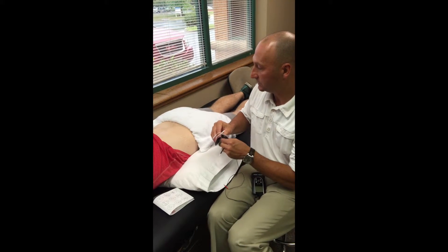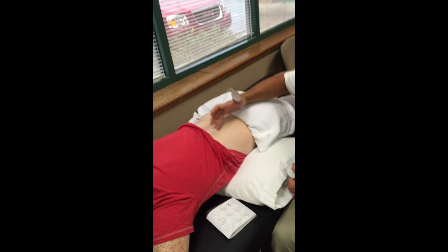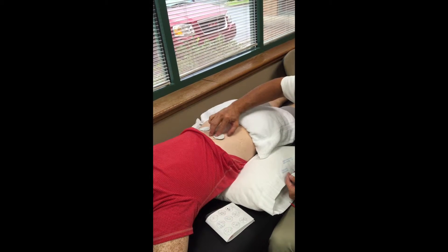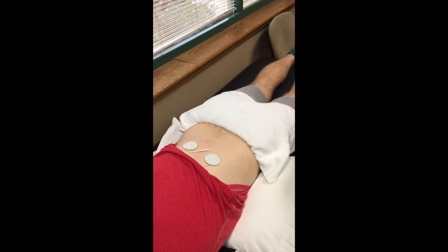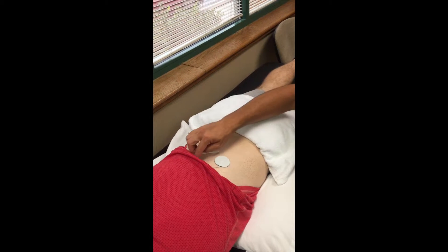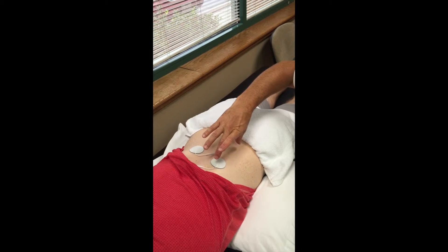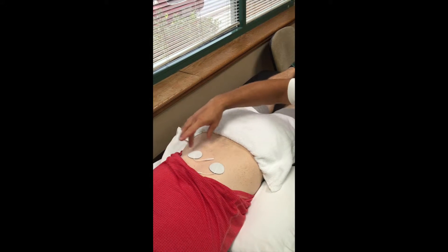In this situation, if we're treating his low back — he's got a lot of acute muscle strain and guarding and spasm here — we're going to apply one electrode on one side and one electrode to the opposite side. There are a number of different arrangements based off what your goal is with the TENS unit. If you're having more muscle guarding and pain on one side, then our arrangement might be to apply the electrodes to just one side of the paraspinals or the other.